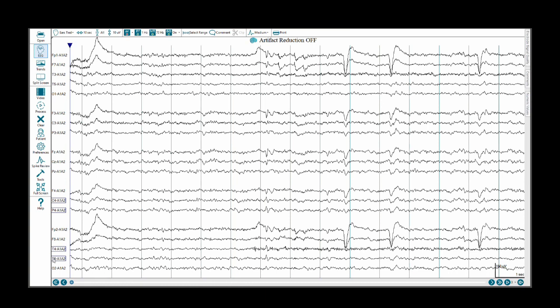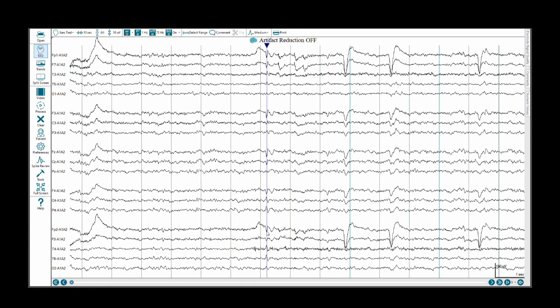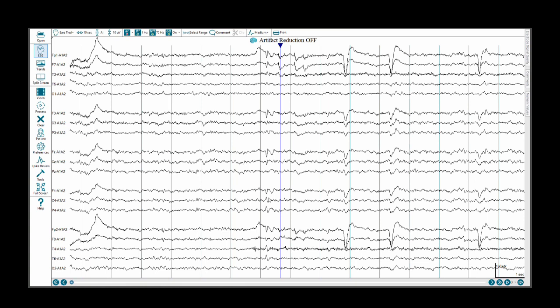When looking at this particular discharge through the prism of the anterior to posterior bipolar montage, it is less apparent what the actual field is and the focus of this discharge is. What we are seeing, and what is the main mechanism for the apparently nonsensical distribution of polarity, is that there is a frontal dipole. So this is one of the cases where the positive component is not radially oriented. This is a tangential dipole. Some of that owes to the way the rolandic fissure folds in upon itself.